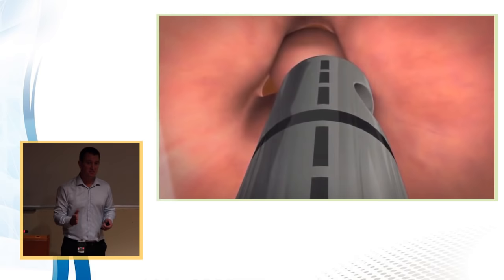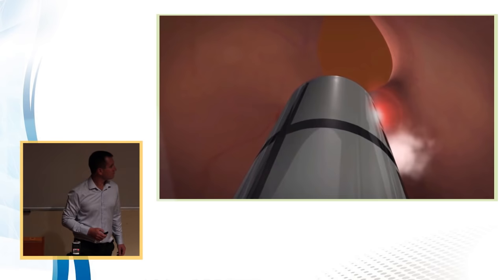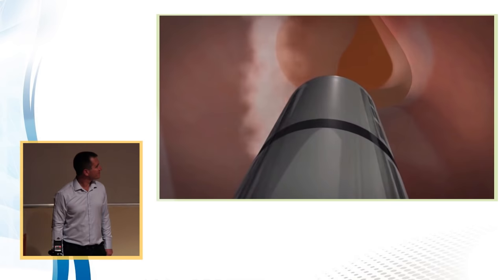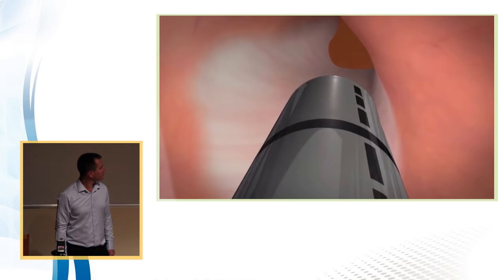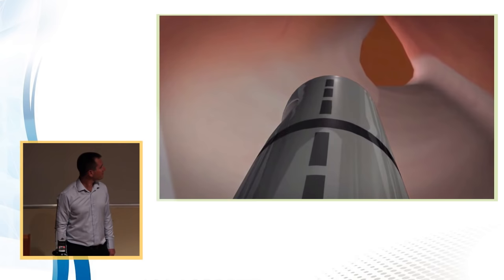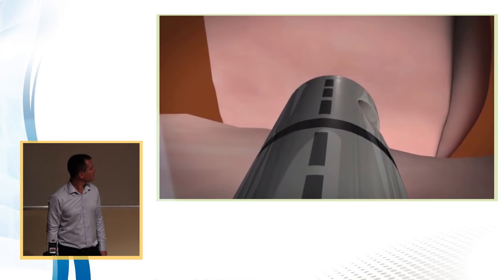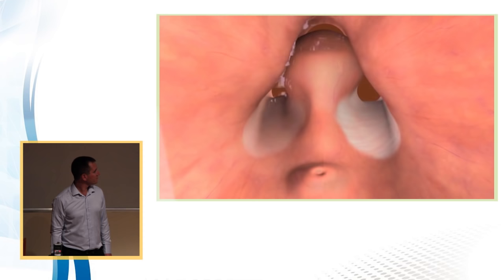Ablation and enucleation, utilizing the Duotome side-fire laser fiber. This is accomplished by initially incising prostatic tissue down to the level of bladder neck fibers. Surgeons then develop a plane down to the surgical capsule, extending from the bladder neck to the verumontanum. Next, surgeons bridge to an enucleation technique to roll the median lobe up and towards the bladder neck. Depending on the size of the adenoma, the tissue is detached as a single or multiple specimens. This new bridge technique allows the surgeon to learn enucleation on a limited scale, still drawing upon ablation for lateral lobe treatment.